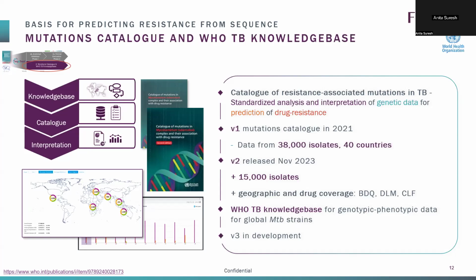So essentially, this grant was an opportunity to say we'll work with WHO to set this up, because again, we wanted to not set up a brand new system. The idea was what can we utilize where there's already maybe data sharing, things that are already being sent, say, from surveillance. TB is obviously in a way a reportable disease, and hence there are annual or at least regular surveys being done, DRS as they call them, the drug resistance surveys that are being done across the world.